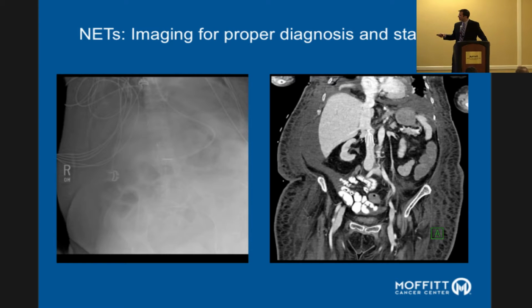You can kind of see there's a feeding tube. We can see loops of bowel. They don't look too dilated, but we don't know exactly what's going on. This exact same patient, CT scan. Now this is one image acquired with a radiograph.